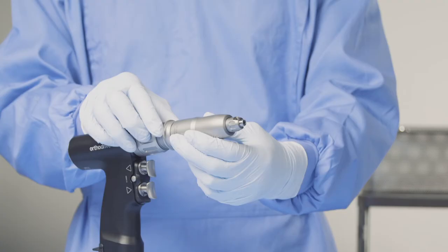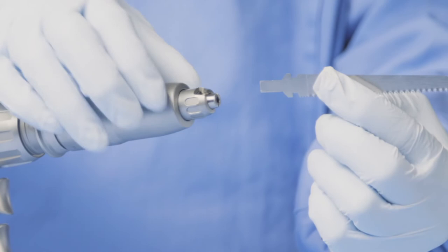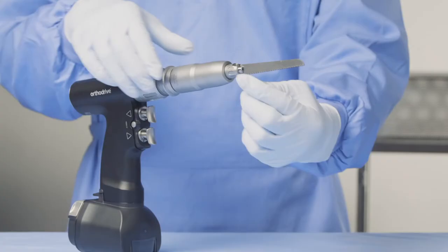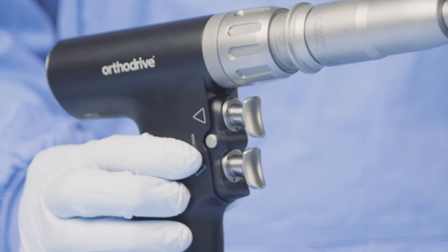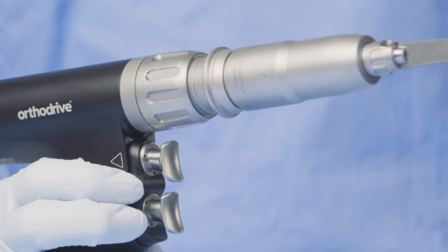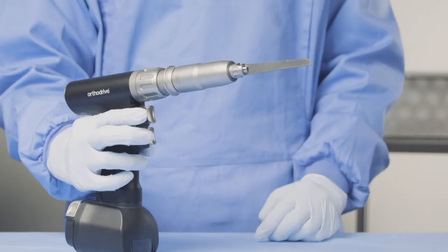Once locked into place, you can take an S84 blade and twist the small collar on the nose of the tool and slide it in before releasing the collar to lock. It's worth mentioning that this should all be done in safe mode with the mode selector in the central position. You can then run the saw by pushing it into the high-speed drilling mode and depressing the trigger.